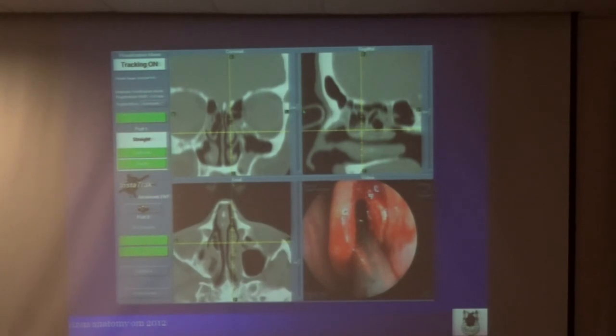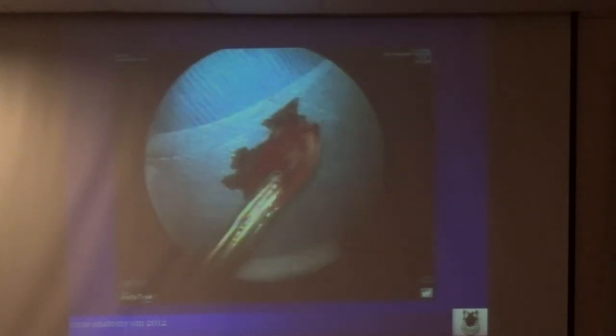You have to be very sharp and use sharp cutting instruments, either scissors or a tool. Never twist, never pull, never turn, never pull out aggressively. It's very, very important to realize, because if you don't understand it very well, you can have a CSF leak just from removing a concha bullosa. It has been reported.